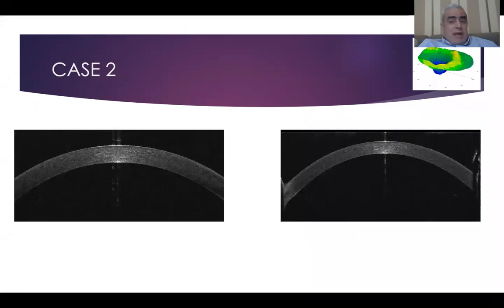I don't know. I will do PRK for a case like this, Dr. Yasser, because, of course, I don't have an epithelial mapping to judge correctly like you did. But do you think we can diagnose keratoconus just from this image of the epithelium? You are convinced of this?